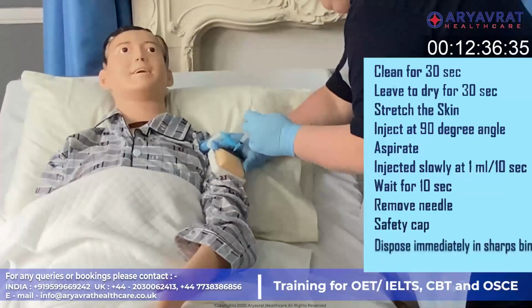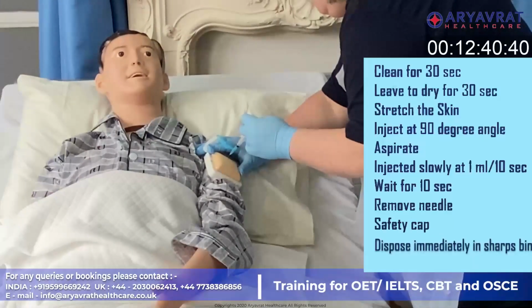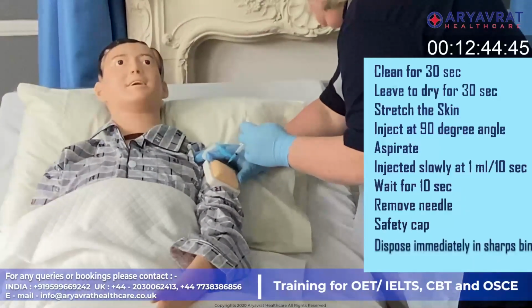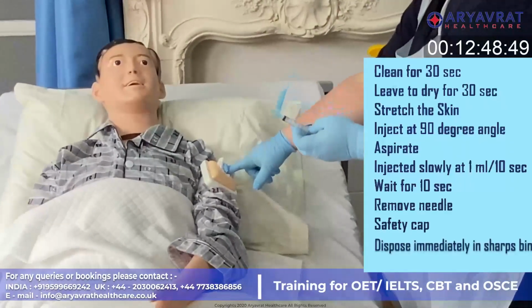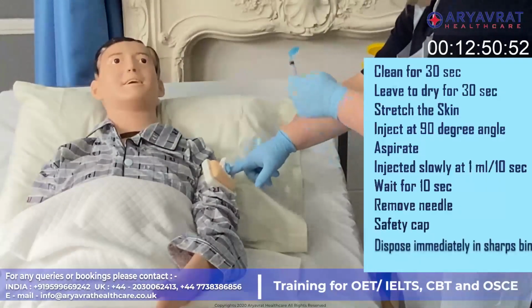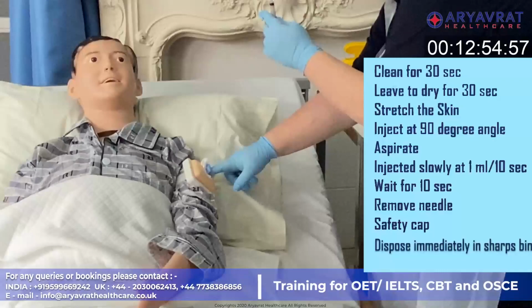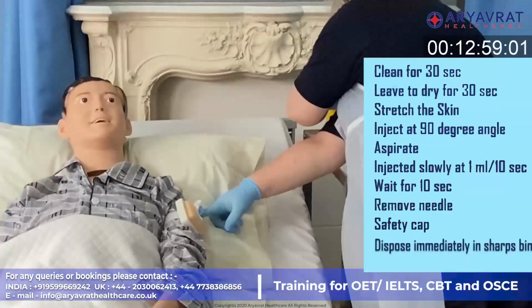So 1, 2, 3, 4, 5, 7, 8, 9, 10. Now I'm going to withdraw that rapidly and put pressure on there. Using the tabs, I am going to activate the safety device on there and dispose of that directly into the sharps bin.